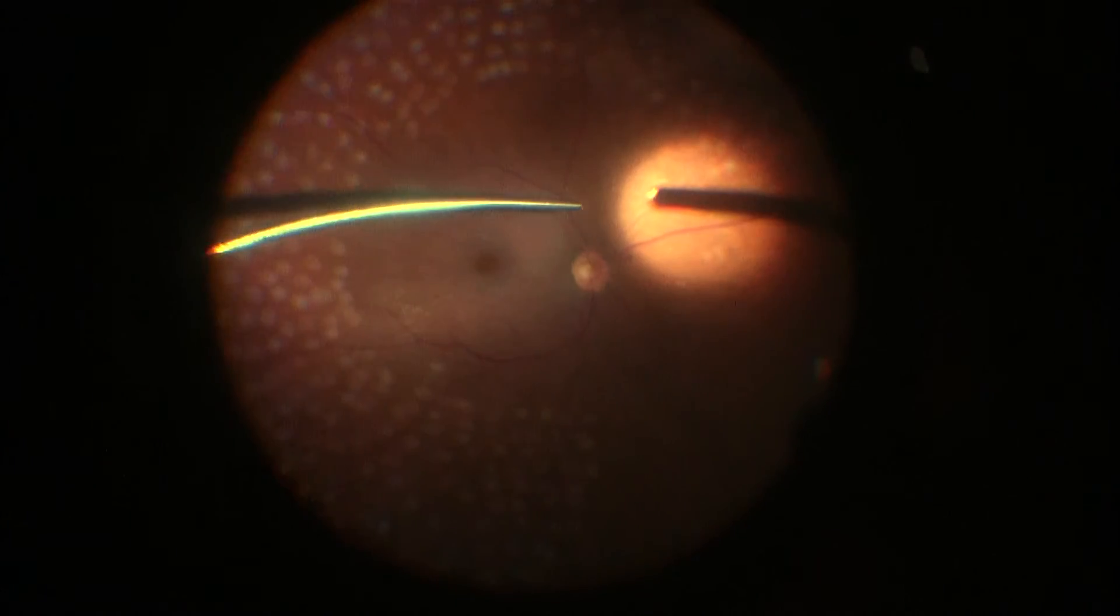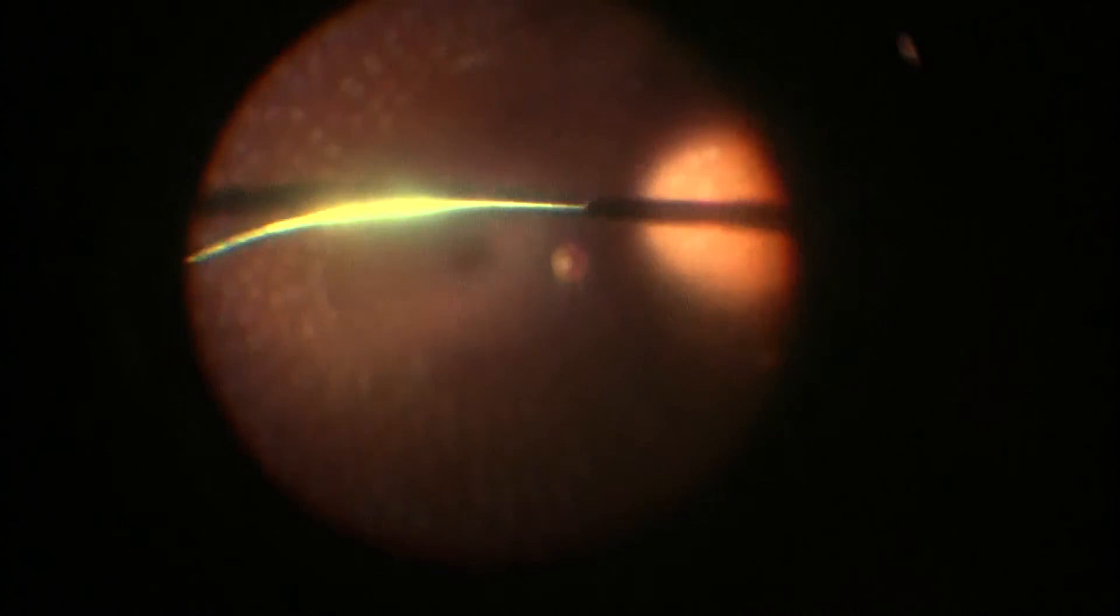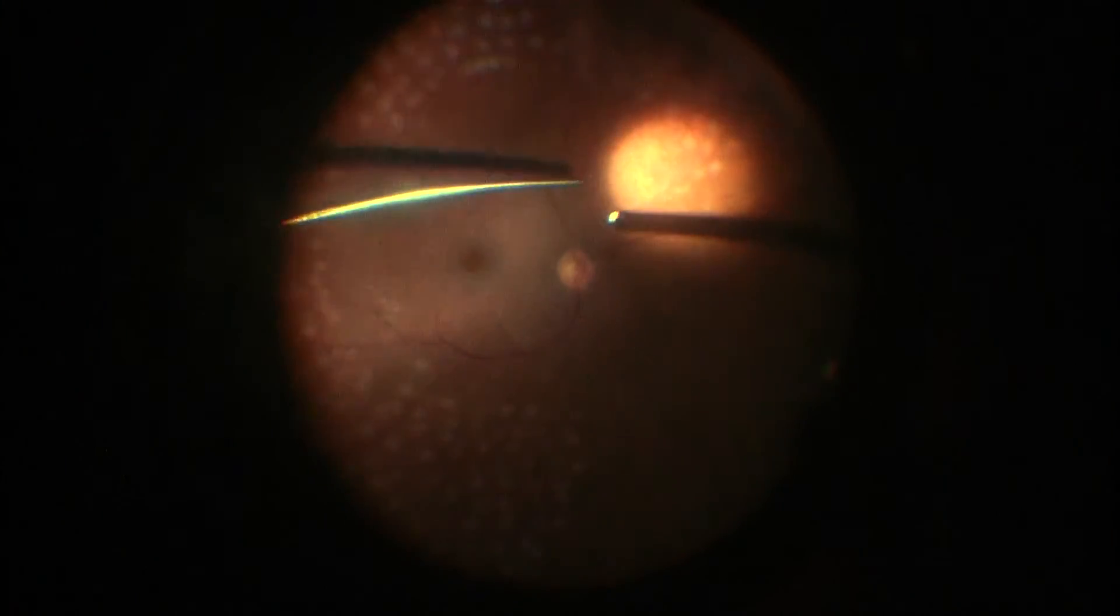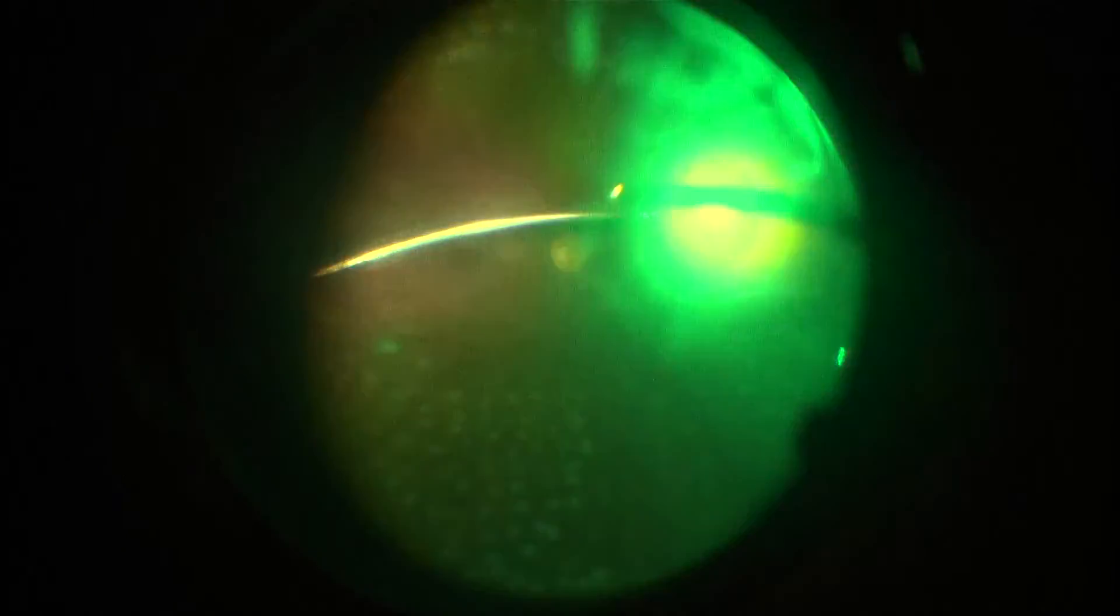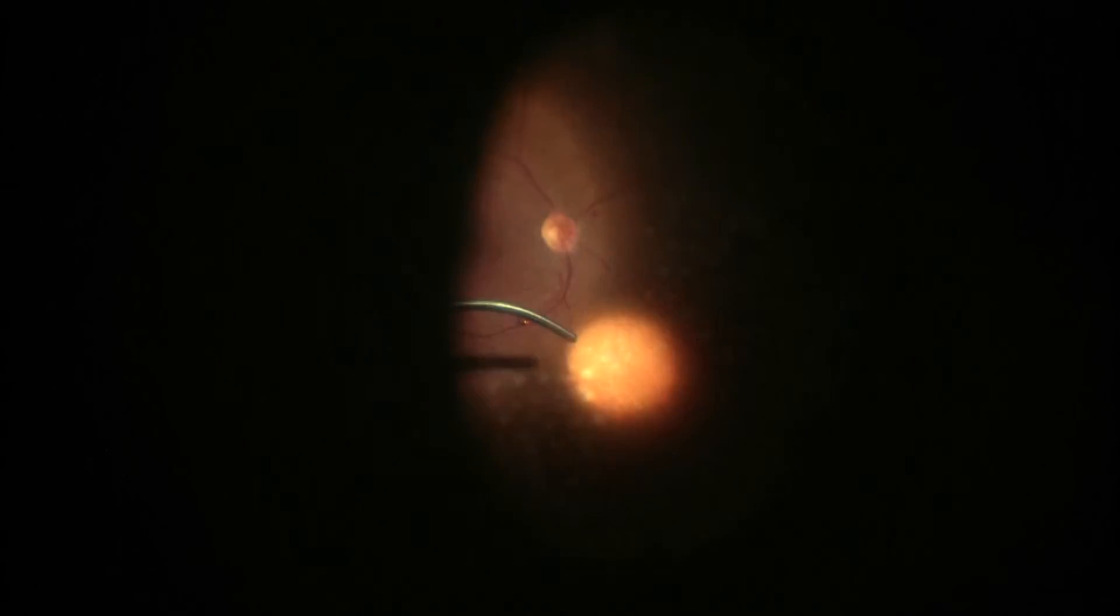The spacing of the spots is fairly important. It does vary depending on the surgeon's preference. But these spots, you do want to space them out more than if you were applying endolaser for retinopexy, treating a peripheral break, or treating retinal detachments. The goal is not to be able to really seal in any subretinal fluid. It's to prevent that peripheral ischemia and ablate that peripheral retina. And so because those jobs are different, you don't need to have that same level of confluence. We're just showing as we're finally filling in the last peripheral parts of the retina, and we're going to start applying that scleral depressed laser.